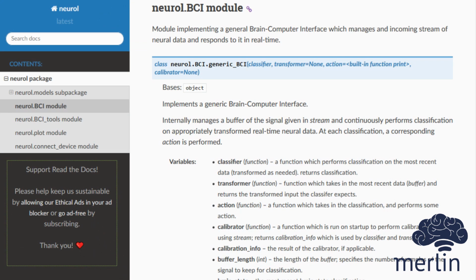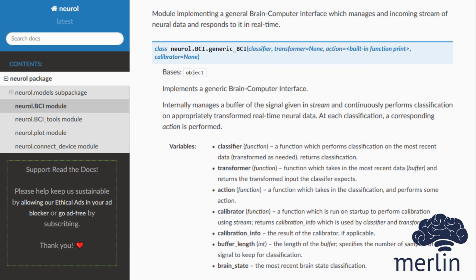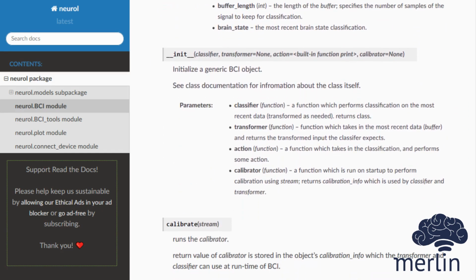Neurol handles all processing of the stream of data and makes it easy for programmers to define their BCI's intended behavior by simply passing functions for each part of the pipeline, and that's all applied in real time as new data is coming in. At the core of Neurol's BCI functionality is the generic BCI class. This is our most basic BCI class, and the others are built on top of it. It can be defined and initialized by providing the following functions.